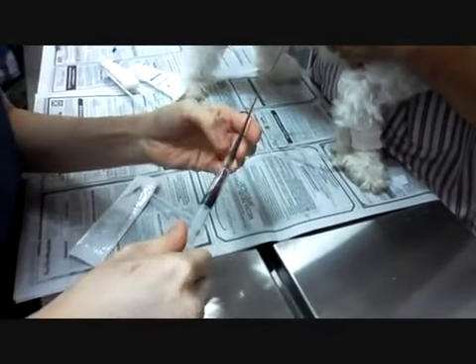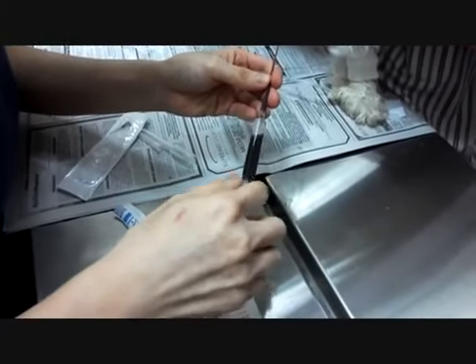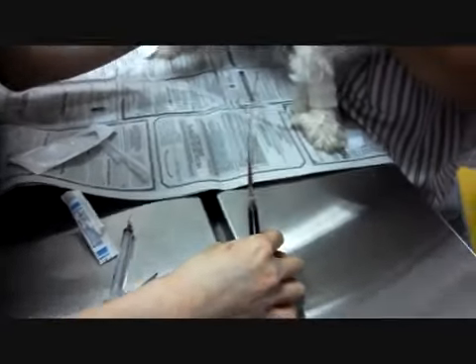In this case, a semi-plastic urinary catheter was used. This can be used for either sex, male or female. The tip of the catheter was lubricated with lubricant before insertion to minimize urethral trauma. The urine is then withdrawn with a syringe attached to the other end.